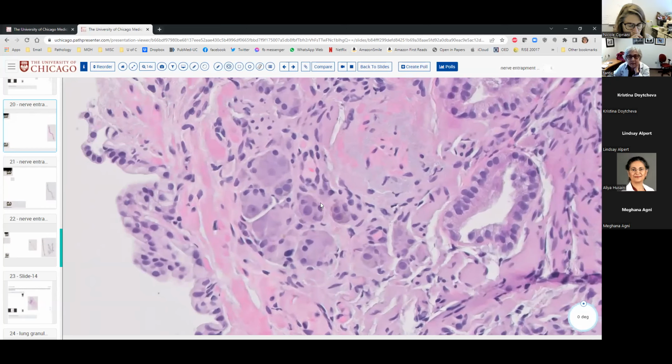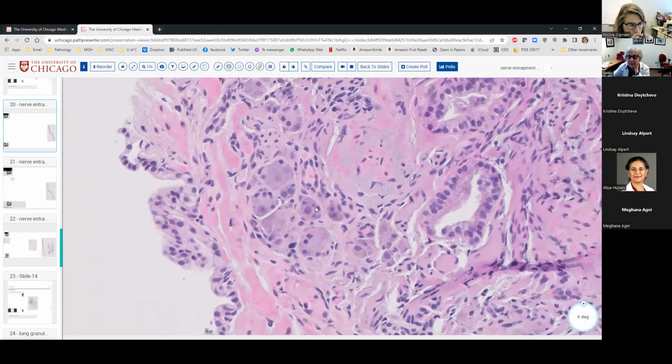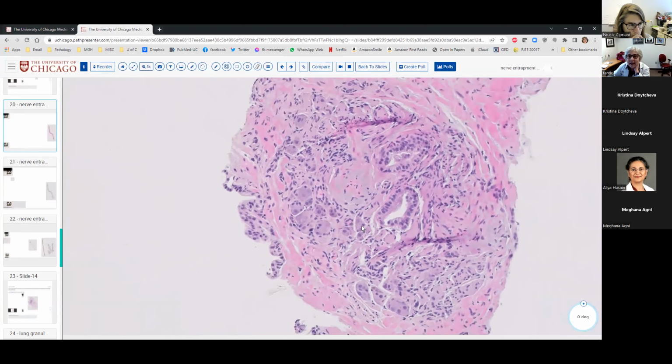Obviously, these cells are quite big. They have abundant cytoplasm, which is mostly granular, and the nuclei are big with prominent nucleoli, and there is also this pigmented granularity. And these big cells are somewhat embedded in this stroma with spindle cells. Nevertheless, the structure is organized. It has this rounded, organized appearance with these cells embedded in the stroma with spindle cells.